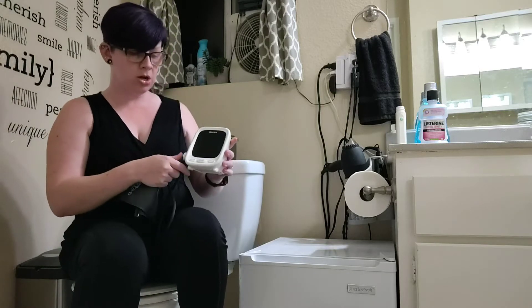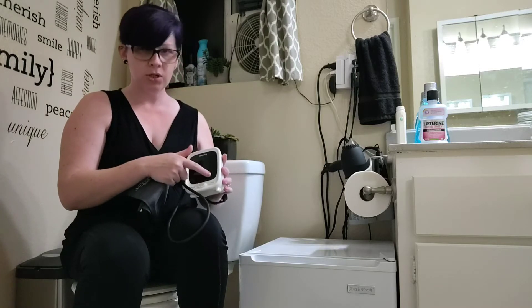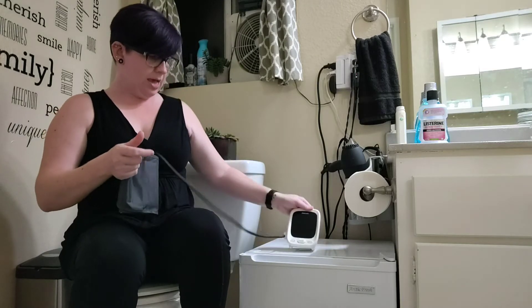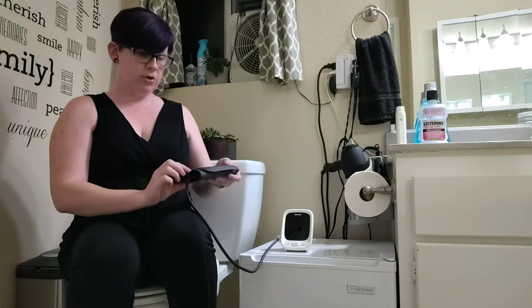It will also say out loud what your readings are. So if you are vision impaired and have a hard time reading the numbers, it's going to say it out loud so you can see and hear your readings and know whether they are normal or not.